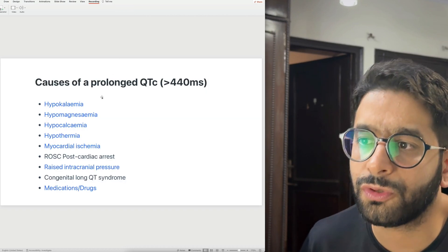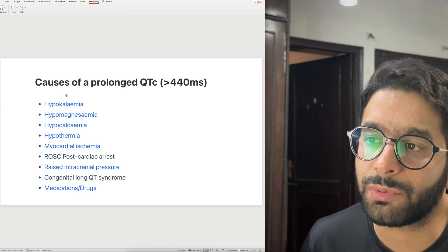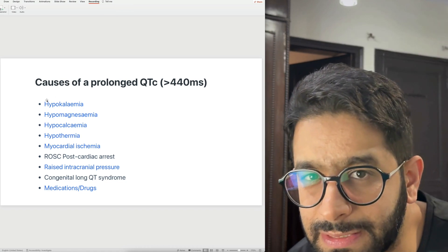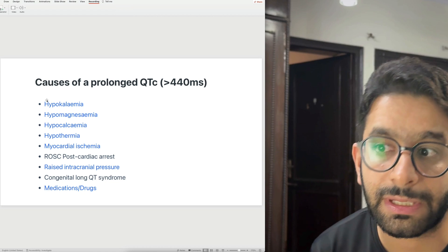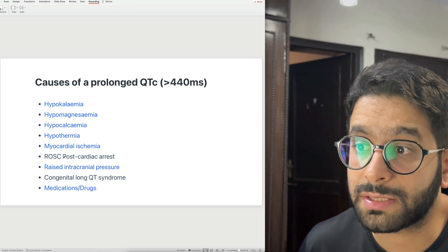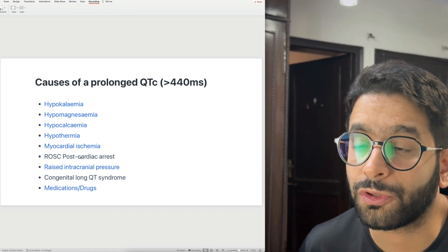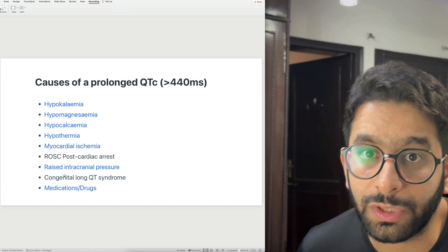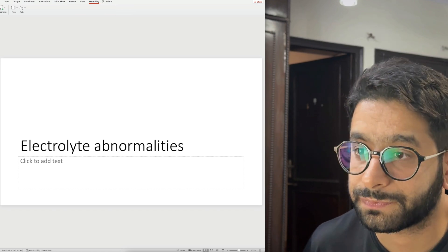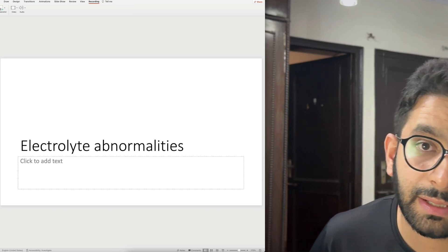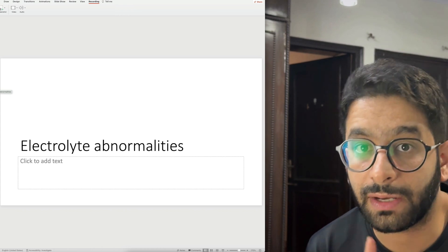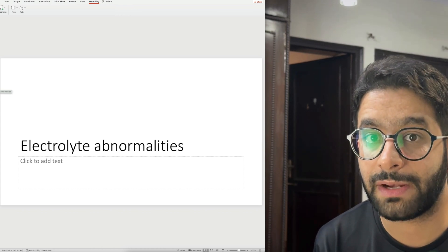There are different causes of prolonged QT, including electrolyte abnormalities like hypokalemia, hypomagnesemia, and hypocalcemia. So whenever you have some bizarre ECGs, check electrolytes — check potassium, magnesium, and calcium. Myocardial ischemia is a very important cause of prolonged QT, as is congenital long QT syndrome, and certain drugs — especially commonly used amiodarone.